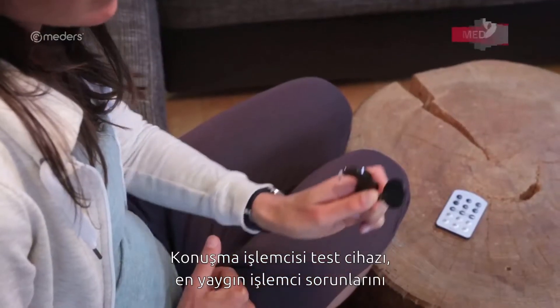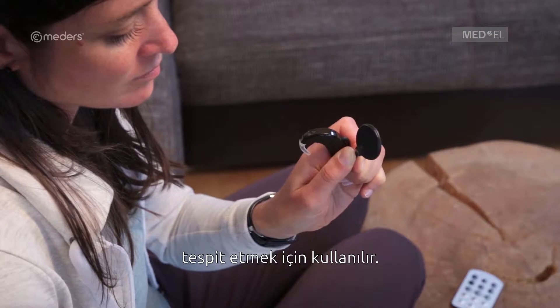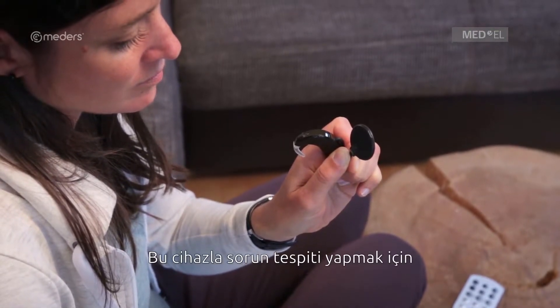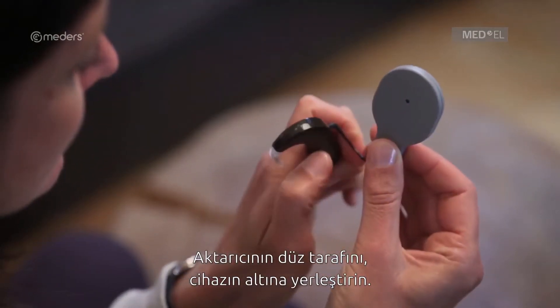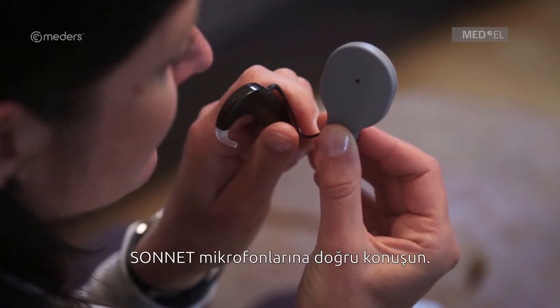The Speech Processor Test Device is a troubleshooting tool for detecting the most common audio processor problems. To troubleshoot with the Speech Processor Test Device, switch on your Sonnet. Place the flat side of the DL coil under the Speech Processor Test Device. Speak into the Sonnet microphones.